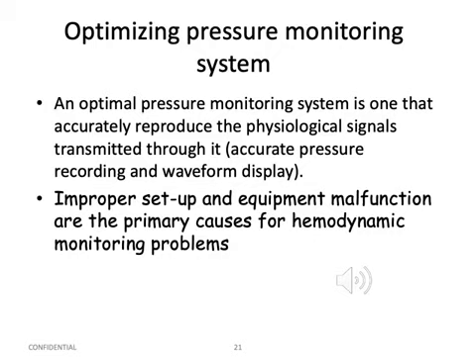That's why احنا as nurses we need to make sure that the pressure monitoring system is optimal، وانه الreadings اللي احنا we are recording هي accurate readings للبريشر اللي موجود أو الفسيولوجيكال سيجنالز اللي already بالتشامبرز أو بالانترافاسكولار system.